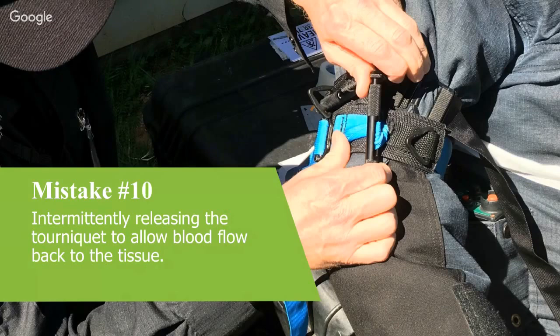Convert your tourniquet to a pressure dressing or a hemostatic dressing at that point if you can. That's the first available time when you might do it. Now, the caveats to that are, you never take an arterial tourniquet off if the casualty is in shock. If they're already shocked, then don't take that thing off. That stays on. Get them to definitive care.